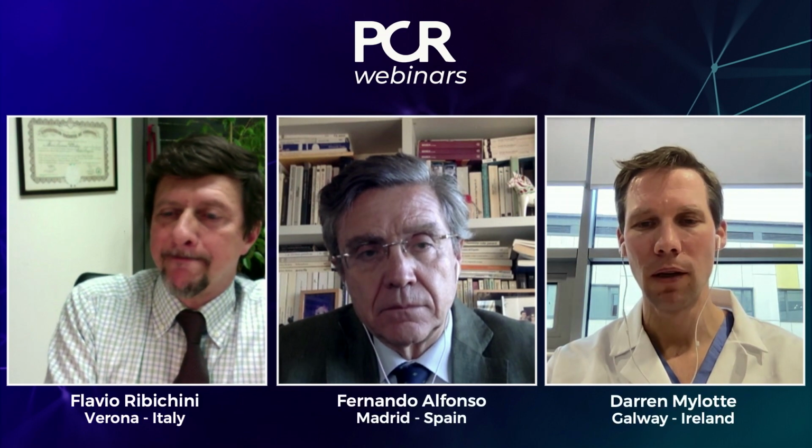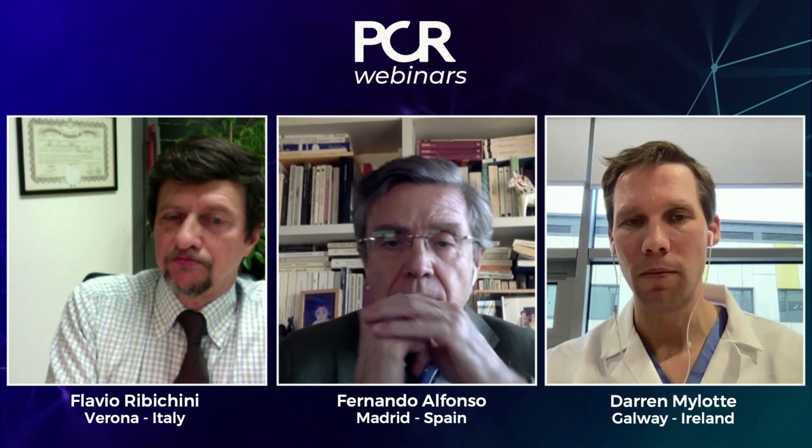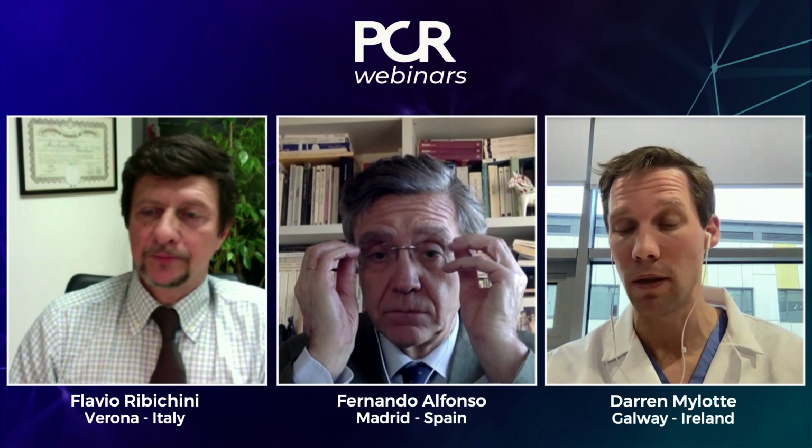Another question from our colleagues. Does it make any difference whether the dissection is proximal or distal to the treated segment, Darren? No, I don't think so. You would expect the dissection to be in the treated segment, to be honest, rather than proximal or distal.